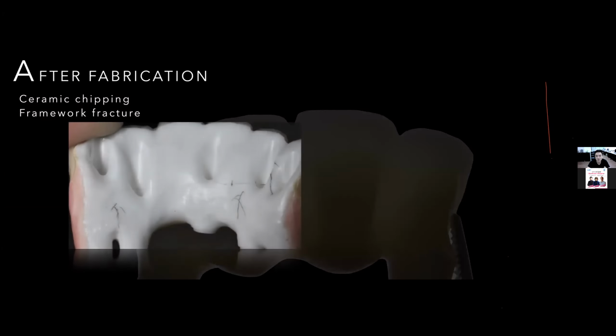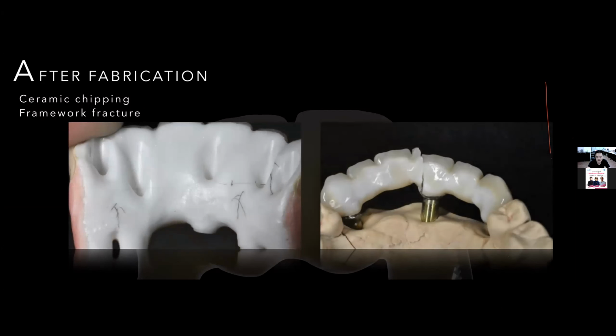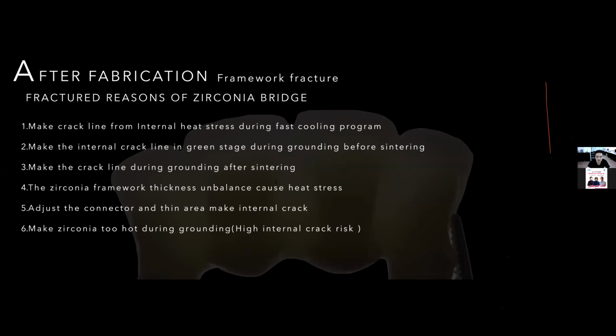But sometimes we will have the problem of framework fracture. Why will the framework fracture? Just only one thing. Because the zirconia is very sensitive to the heat source. We have many procedures.